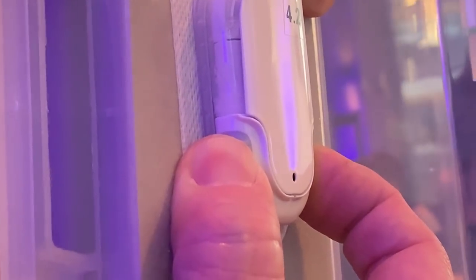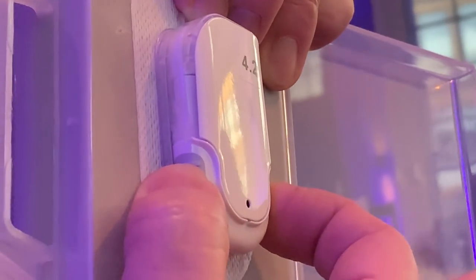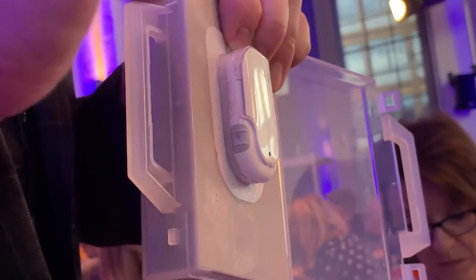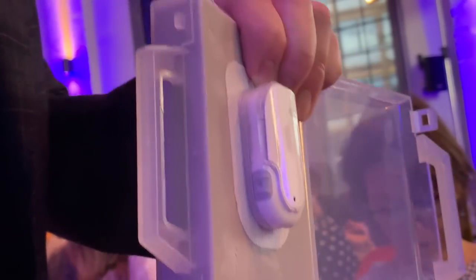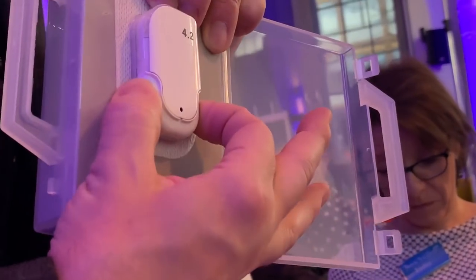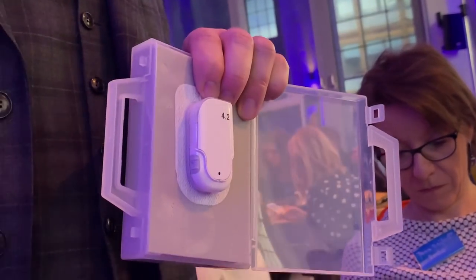Okay. Now, it's not very loud, so you have to listen carefully. Okay, so I press and hold. That was the sign. I can now program, and I go 1, 2, 3, 4, 5. Now I wait. Was it 5? Yeah. Okay, I press one more time. And this dee dee dee dee dee tells me now the bolus actually starts running.